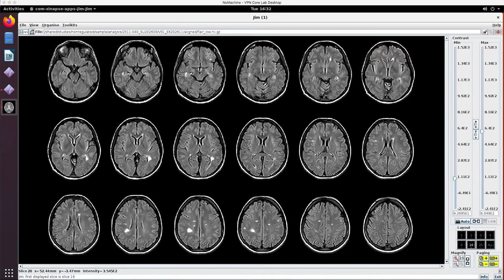And so that's simultaneously the great advantage of T2 lesion quantification and T2 lesion assessment in general, and also its Achilles heel. It is incredibly sensitive to all kinds of pathology, and so we will see as a lesion most things that involve any kind of focal alterations. But at the same time, it is very nonspecific. It represents a spectrum of pathologies that can have a dramatically different impact on clinical and patient outcomes. Obviously, mild edema is substantially different than complete loss of axons in an area.